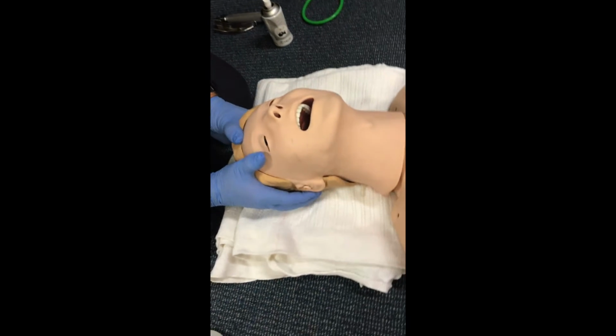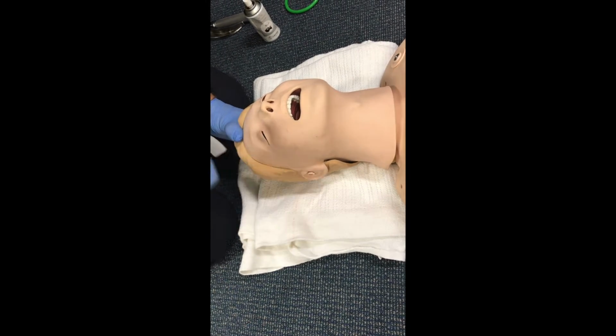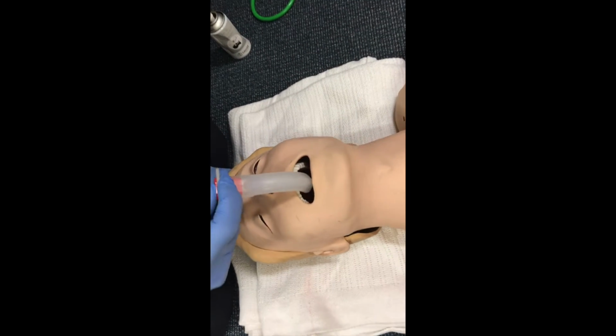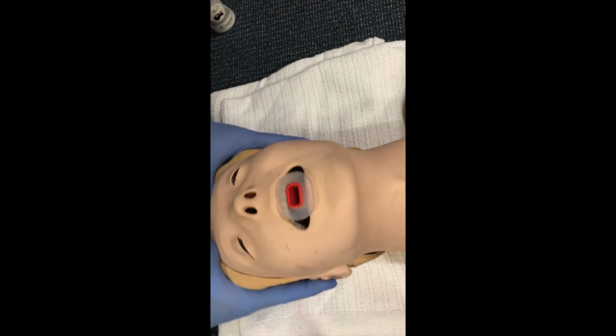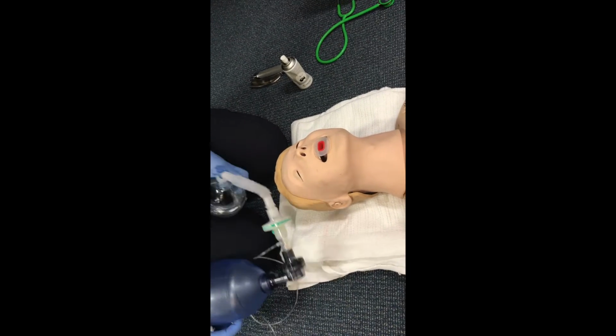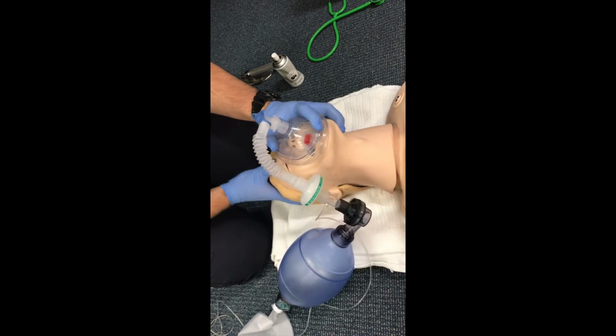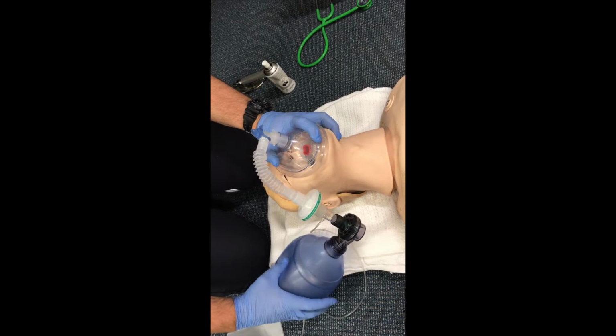Measure the OPA from the corner of the mouth to the corner of the jaw. You can lubricate the OPA with water or the patient's saliva. Hold the OPA with its natural curve upside down. Pass the tip first and insert halfway into the mouth. Rotate 180 degrees. Insert until the flange rests on the patient's lips. Then you look, listen and feel for air movement.